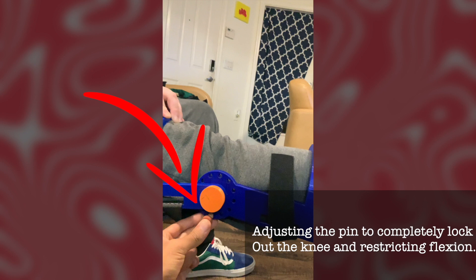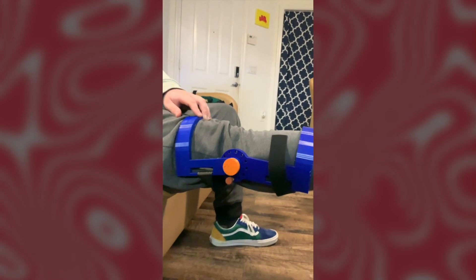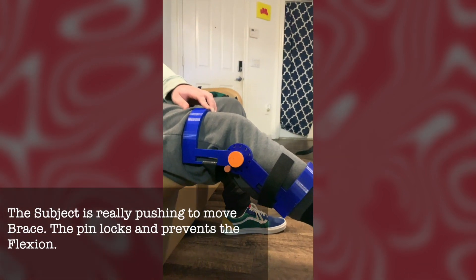I've readjusted the pin in such a way that now the flexion of the knee is limited even more than the previous setup. As you can see, the subject is really trying to push through the pin, but the pin blocks the lower half of the brace from going all the way.